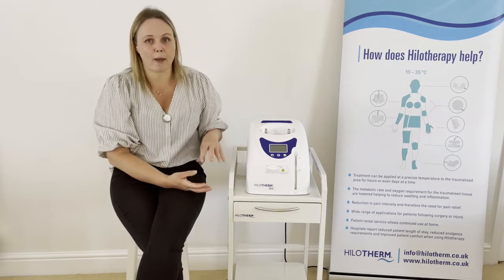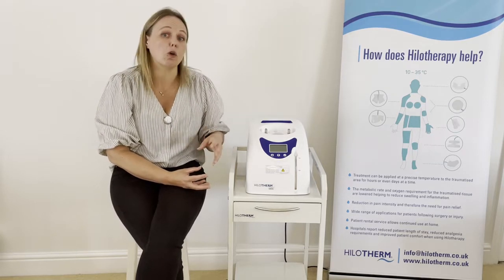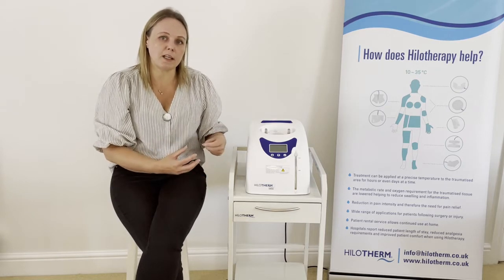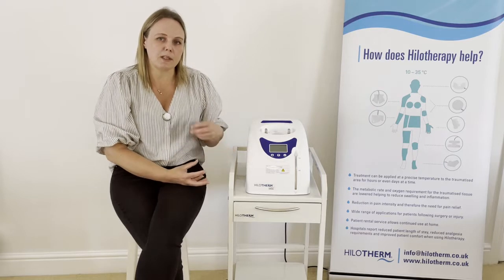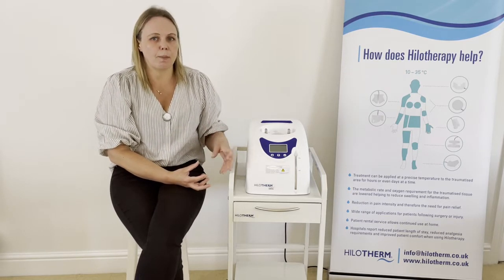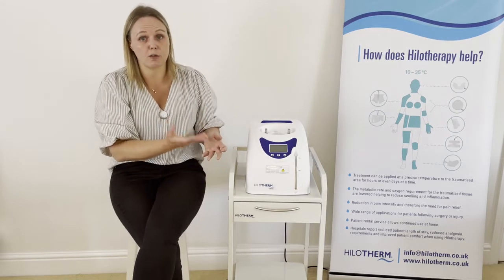The main thing to remember is that Hilotherm is not an ice-based treatment — we are not trying to replicate ice. It is temperature controlled and designed to be used safely for long periods of time, so it's very important that you work within the temperature range. You may find that older patients are happier at the higher temperature ranges.